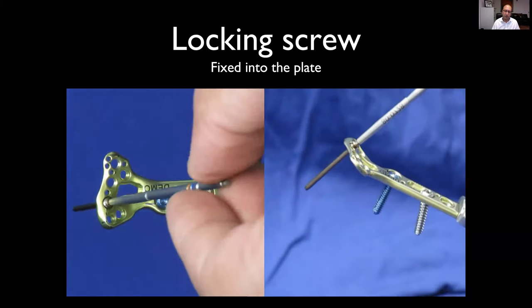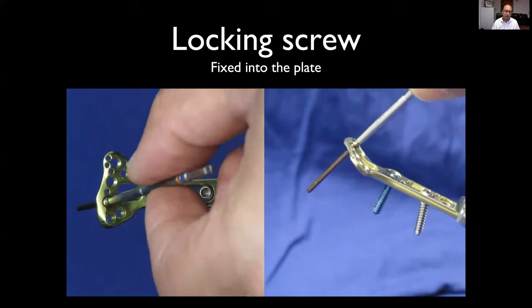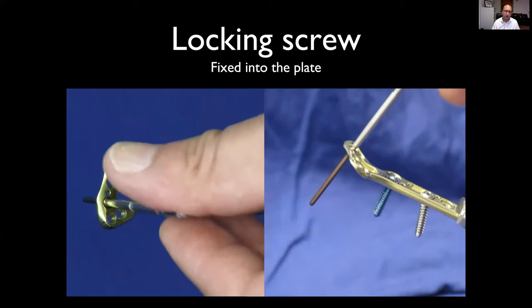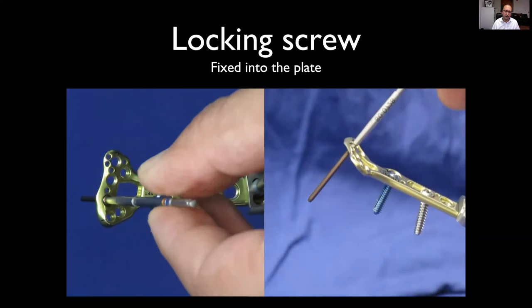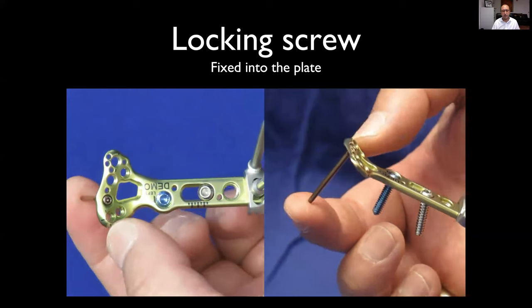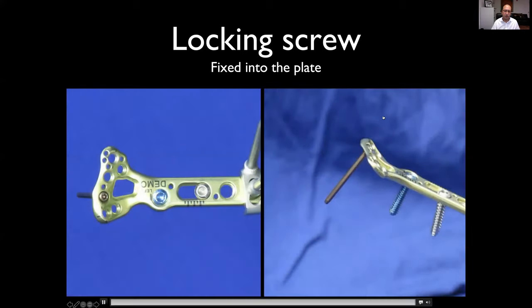This is one of the pegs — a smooth peg in a divergent position against its fellows distally. This has a very robust fixation and will offset compressive forces acting perpendicular to the plate from the joint, because this is used for periarticular distal radial fixations.